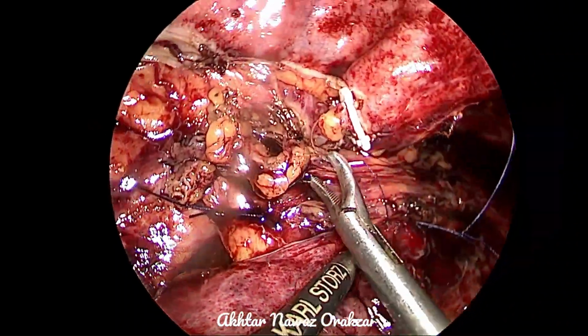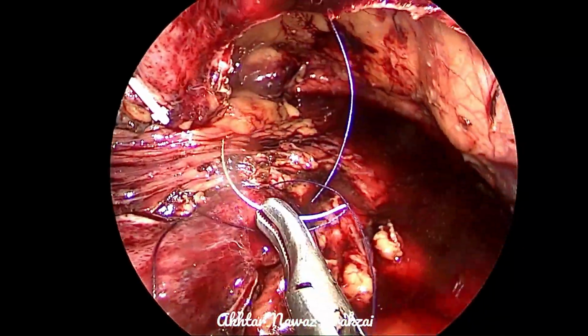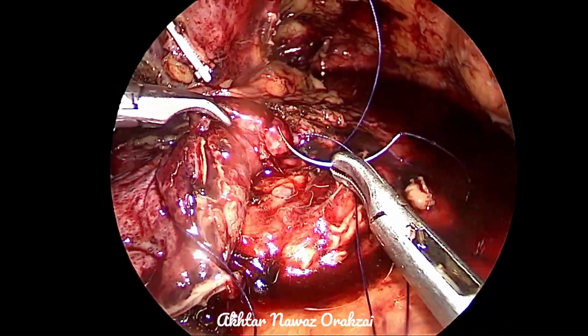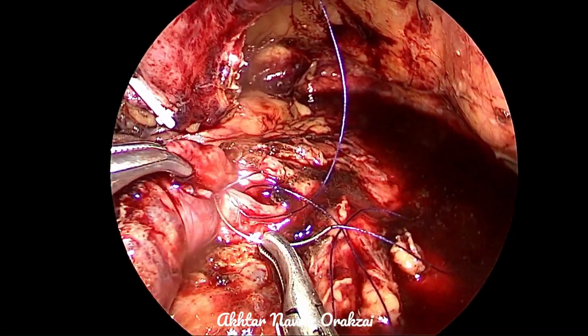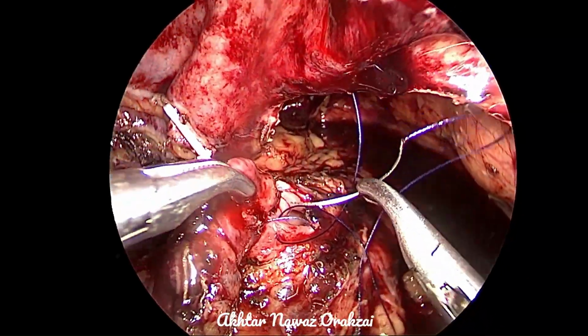Before placing the stent, we just take this stitch. This cornering suture is extremely important.